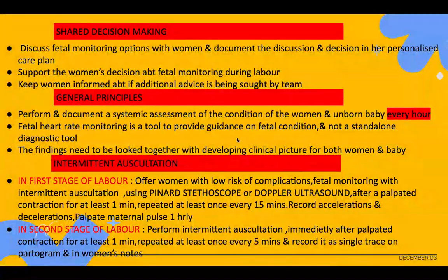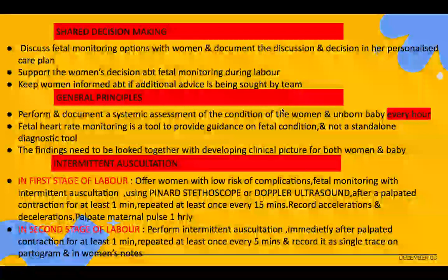Now, what are the methods of auscultation, right?